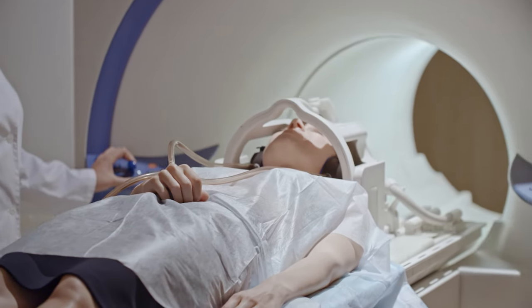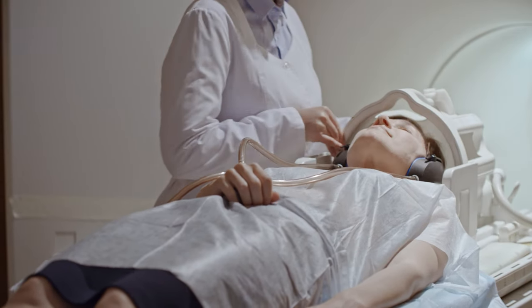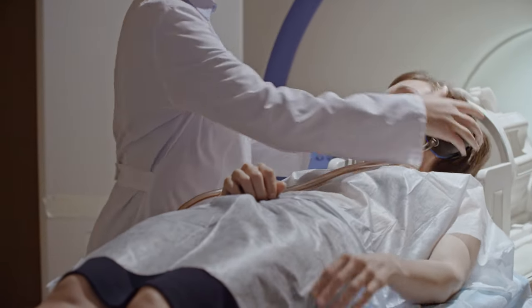Standing MRIs are another way of measuring scoliosis, but they're more expensive and done in slices, meaning you're comparing two different slices as opposed to one image that sees everything in one shot. Therefore, standing MRIs are not necessarily more accurate or reliable — in fact, they're more likely to have less accuracy or reliability than a traditional x-ray.